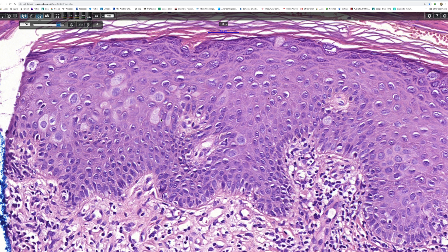If all mucin stains are negative and you still think it's extramammary Paget's disease, then EMA and CEA would be very helpful as they would be strikingly positive. So would CK7, but the problem with CK7 is that it can be picked up by squamous cell carcinoma as well sometimes, so I wouldn't bother doing that. If they're all negative, we could think about superficial spreading melanoma, using markers such as S100 protein, melan A, or SOX10. And if we think it's Pagetoid Bowen's disease, P63 would be the best option as it will be strikingly positive.